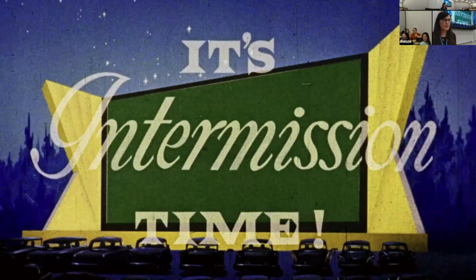Sorry about that. Yes. So basically, there are different implementations of how compressed sensing works, the different acquisitions that are matched with it. Our particular one is no more or less sensitive to motion than, let's say, the GRAPPA example that we showed alongside it. The only big difference is that we've shortened the scan time, and that allows us to combat motion.